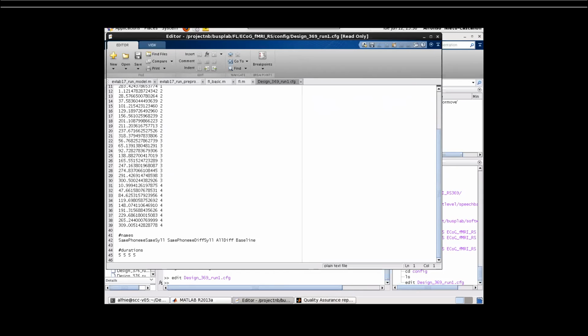I think the onset times for that study, and I could be wrong, are based on the MATLAB script, which I've been running. That's where I got them. No, I mean the actual experimental MATLAB script that gets run. So how do I sync them with the scanner?